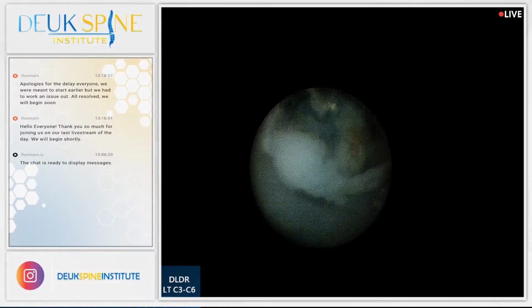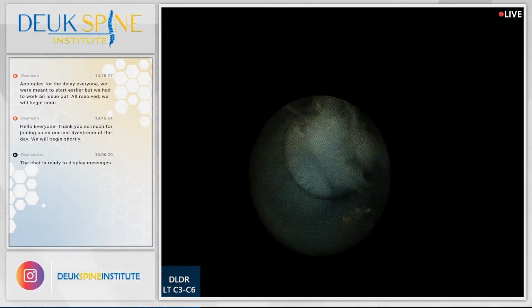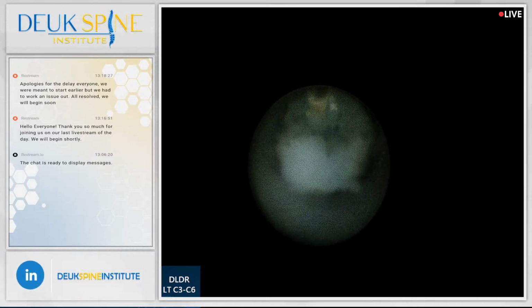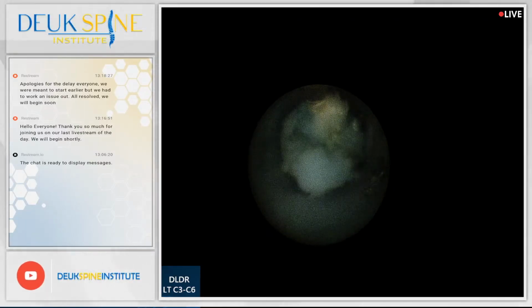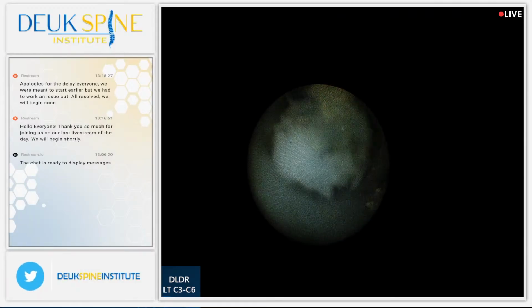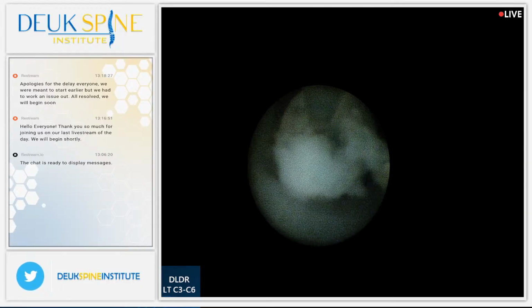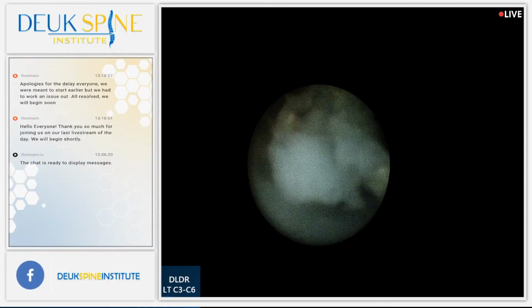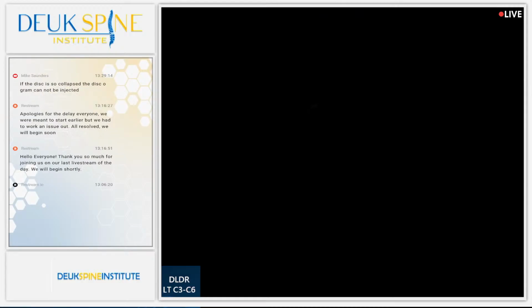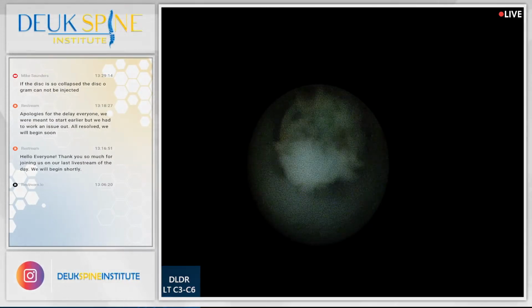We need more laser energy, guys. It's just not having the effect it's supposed to have. Are you trying to minimize the energy? No, it's supposed to be the same.